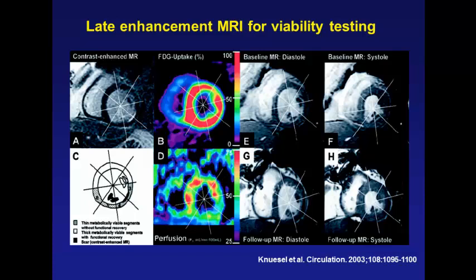We did this 10 years ago. We had an MR and a PET CT, and we still have now 5 MRs and 3 PET CTs, and we will get a PET MR as well, but not because we are 100% sure that this is the future. If I had no PET CT and no MR, and could freely choose between a PET MR and a PET CT plus an MR, I would of course go for the latter, because then I have a PET CT and an MR. With the PET MR, I do not know exactly whether I could do all the daily business.